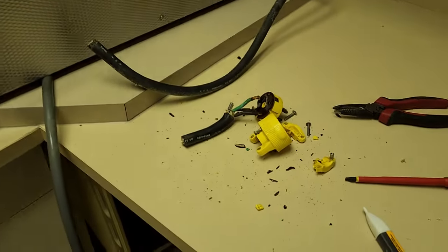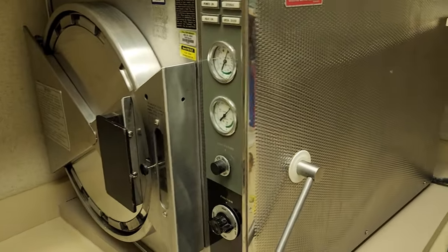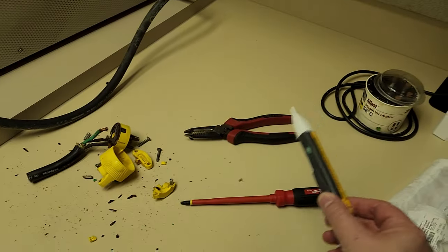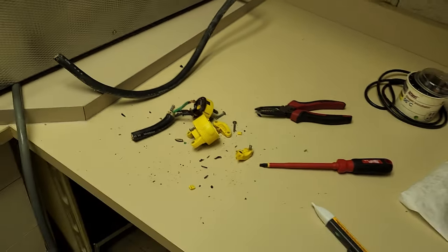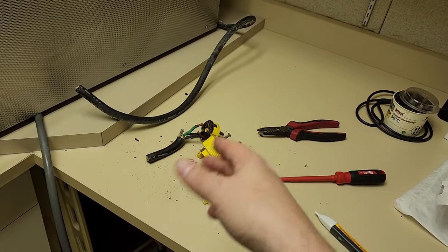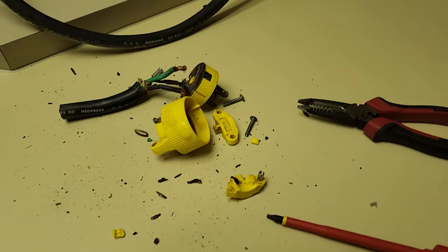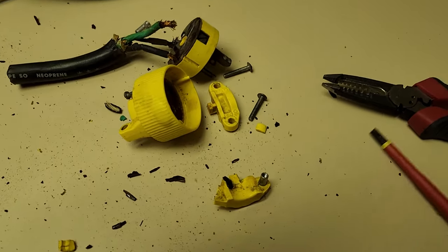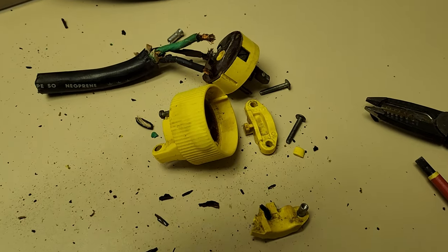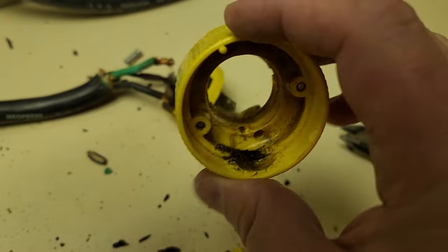So I went and I checked the breaker, and mysteriously, the breaker itself looks like it's energized, and based on the chicken stick, I have power through my breaker, as far as I can tell. Obviously, the breaker must have prevented a fire. Something prevented the fire here, other than just NEMA plugs and electrical code, but holy cow, guys, this is a hot supper.